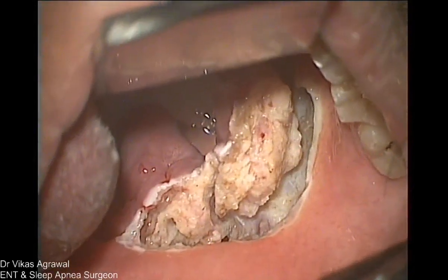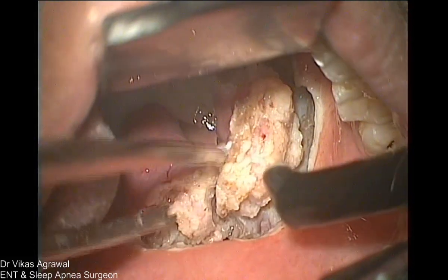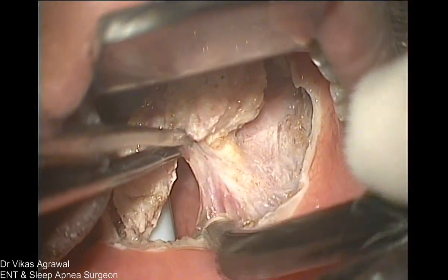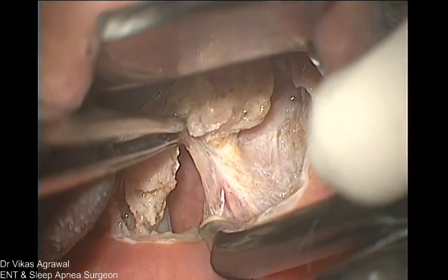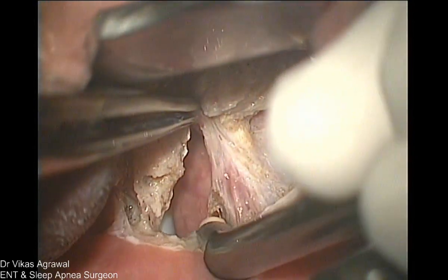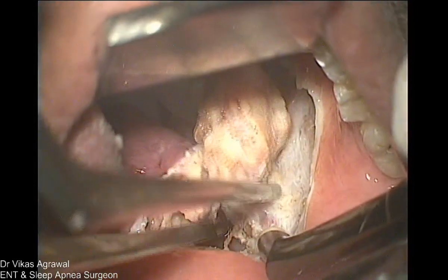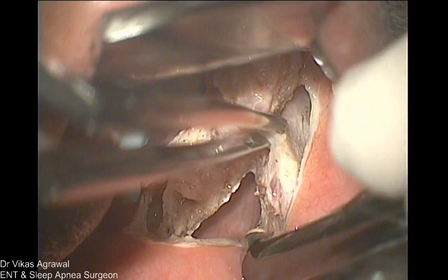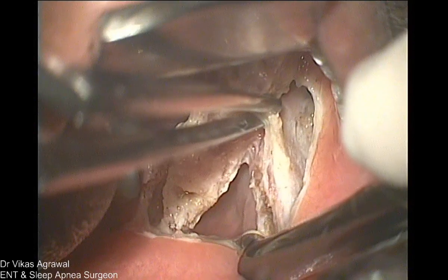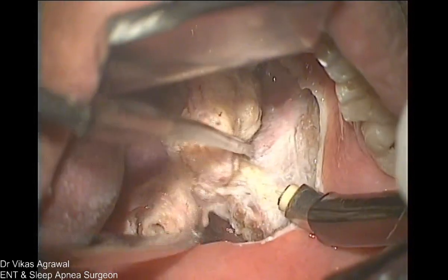So let me divide the medial fibers completely. Tooth forceps. So you can see this medial fiber, correct? Excellent. These are the medial fibers which I divide, the palatopharyngeal fibers. Divide completely and reach the lateral pharyngeal wall. Once I reach the lateral pharyngeal wall, can you see the lateral pharyngeal wall? Seen very well. So now this is the extra tissue.